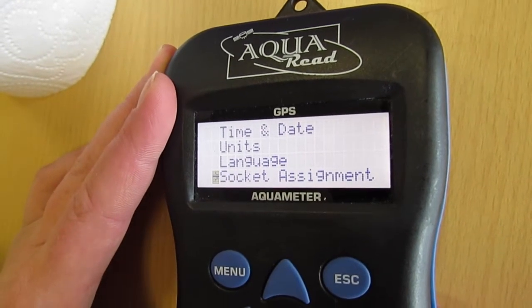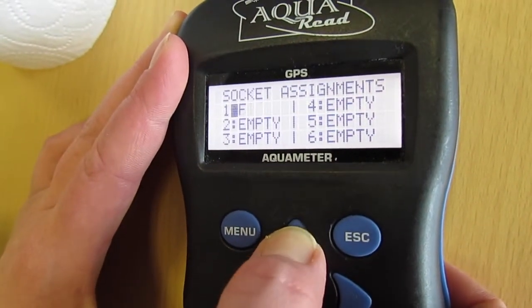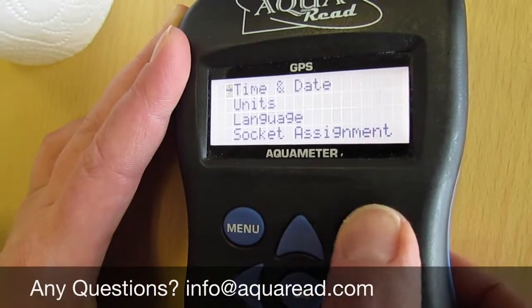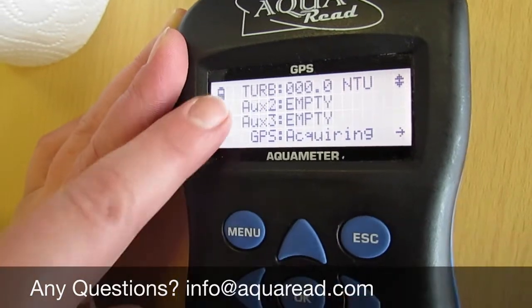Go to socket assignment. As we put it in AUX1, scroll through to TURB and press OK. Now TURB has been installed into AUX1.